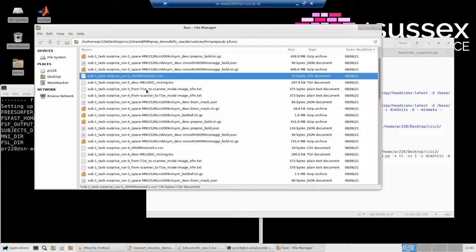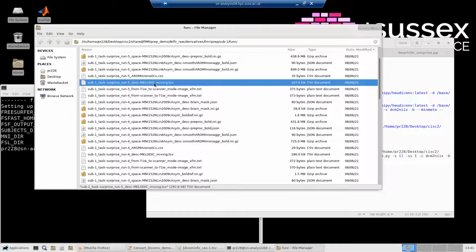Okay, so basically the ICA is done by FSL MELODIC, and then you can do the manual intervention if you want. The ICA-AROMA step is literally automating it. You run the ICA in MNI space, and it uses certain features, such as how correlated the component time series is with the motion parameters, for example, or spatial features.